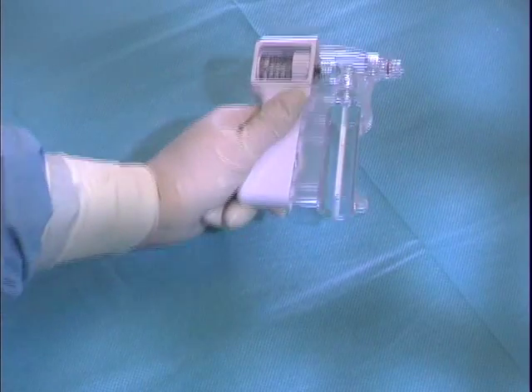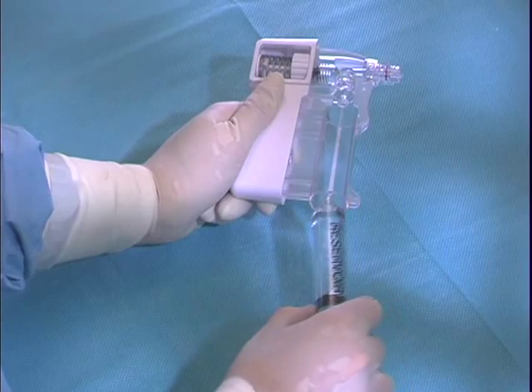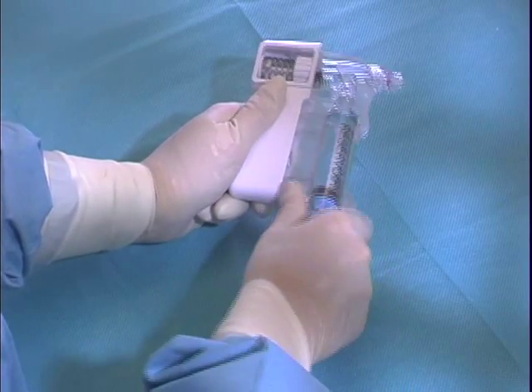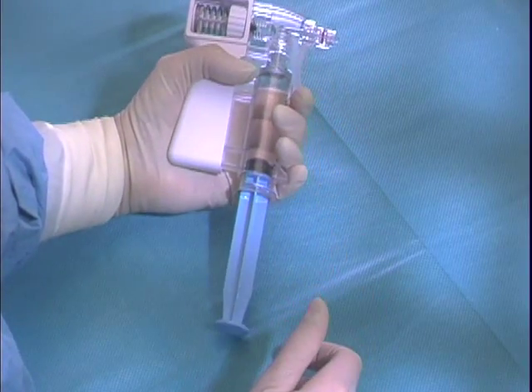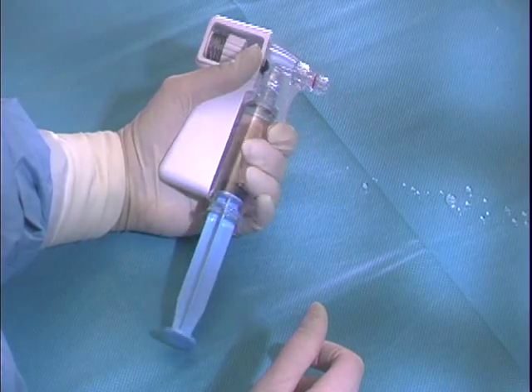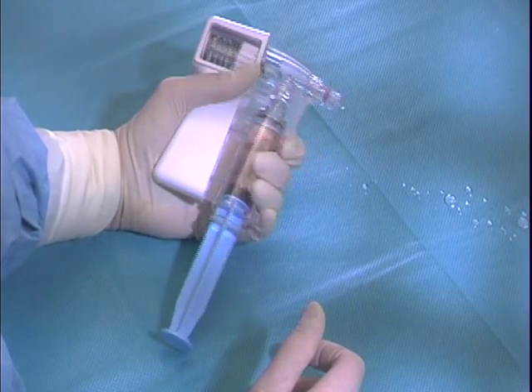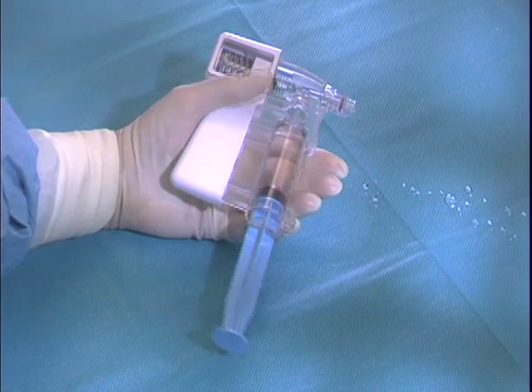If the clinician is using the Squirt fluid dispensing syringe, they will need to prime and debubble the product. To prime the Squirt, attach a 20 ml syringe containing saline to the bottom portion of the Squirt. Hold the Squirt in an upright position and squeeze the trigger bar until all air bubbles are expelled out of the check valve area of the Squirt.